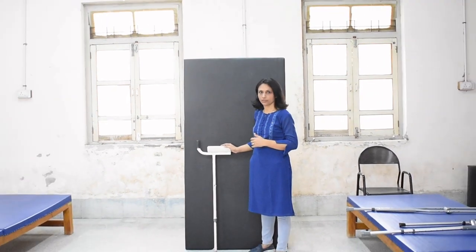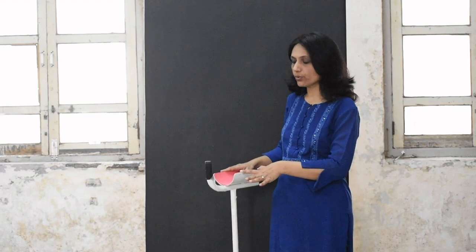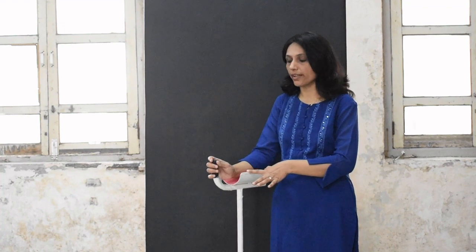Now let us learn about the third type of crutch. This is called the gutter crutch or forearm support crutch. As mentioned in the introductory portion, there is a need for this type of crutch because patients who have rheumatoid arthritis have a condition with joint deformities and extreme pain in the wrist and hand joints. Those patients cannot transfer weight from the upper limb as we have seen in the previous two types of crutches.